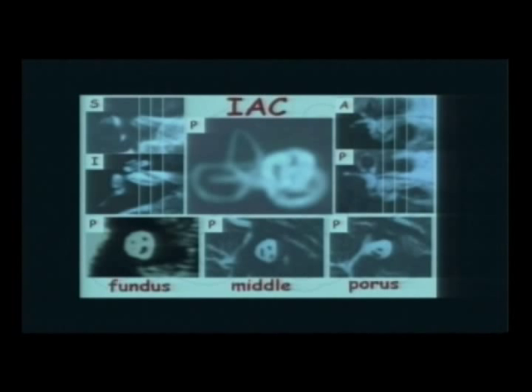And then if we take a lateral cut in the axial or a lateral cut in the coronal, here you are going to see four nerves. Cochlear, facial, superior, inferior vestibular. In the mid part of the canal, you are going to see three nerves. Facial, cochlear, and vestibular. In the medial end of the canal, coming out of the canal, you are going to see two nerves, which are who? Facial and vestibulocochlear. But you never find one nerve. If you see one nerve, this is an anomaly.